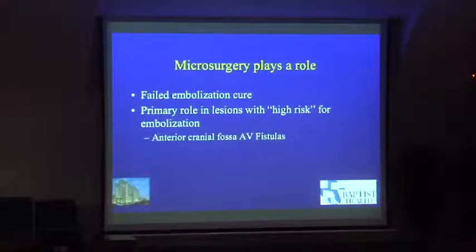If you have to go through the ophthalmic artery to embolize a fistula, you may consider not doing that for safety reasons. And I had 2 patients over 10 years that lost vision because of my bad judgment, where with a simple small craniotomy I could have cured this patient without exposing the eye to that risk. And this role is getting smaller because now, with better distal access catheters, we can get further distal through a transvenous approach and maybe avoid this more aggressive treatment with surgery.